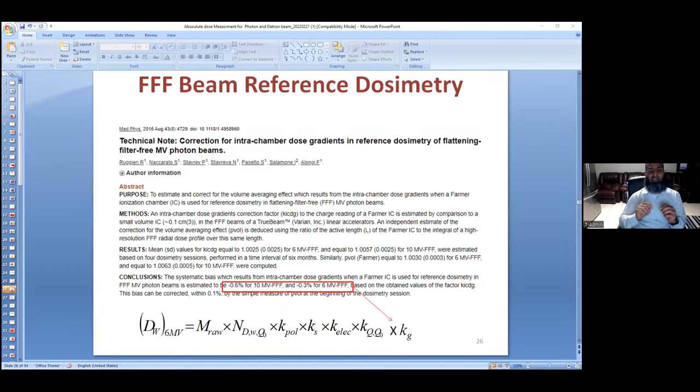So what is the uniformity correction factor? It's because the radiation coming from the radioactive source is not uniformly distributed, especially when the chamber is almost 2.5 centimeters long. Your normal Farmer chambers are 2.4 centimeters long. So this non-uniformity has to be corrected. This is what they're doing here, as I showed in the presentation. So you can see this non-uniformity correction factor is actually accounted for here.